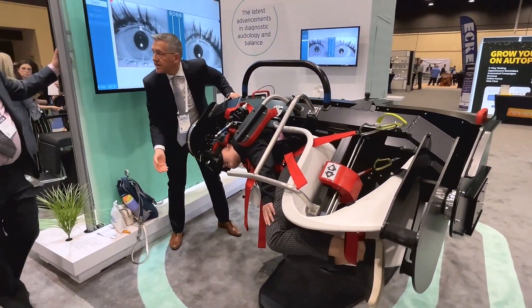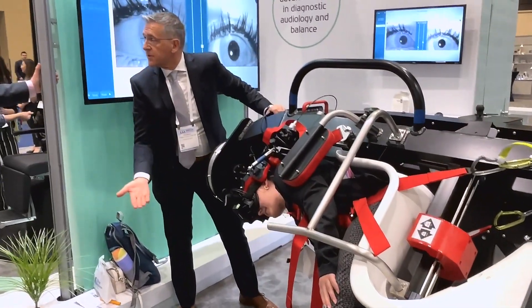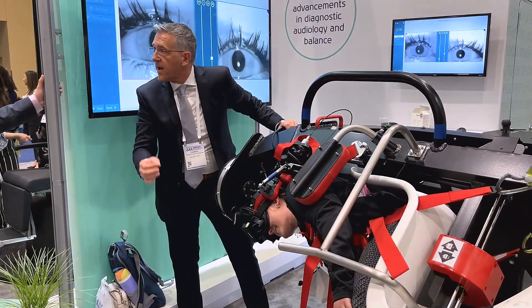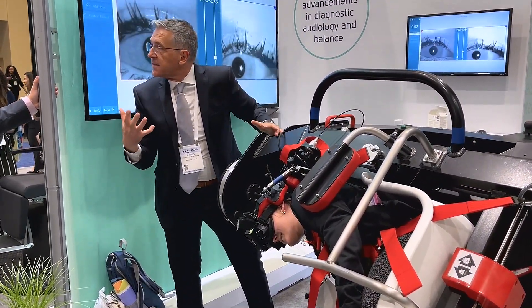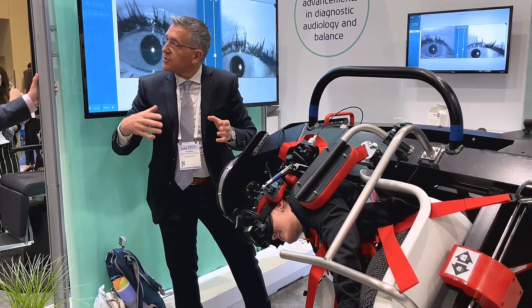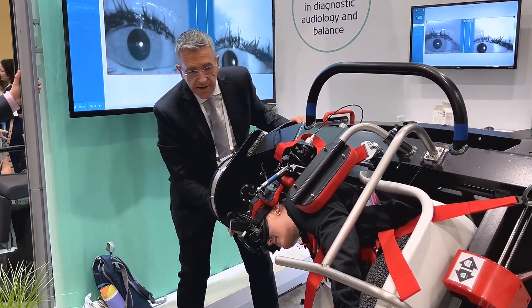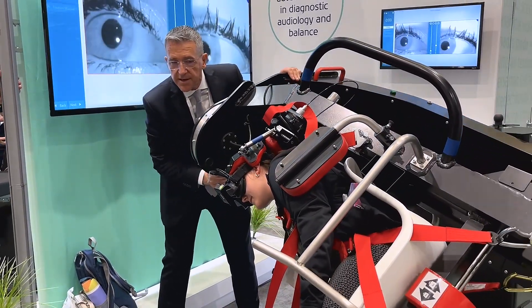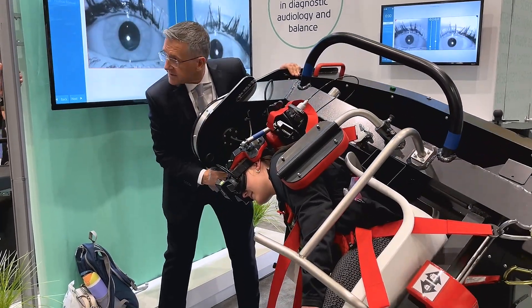Then we'll make a barbecue — a dynamic barbecue — with impacts to transmit kinetic energy to help the particles progress into the canal. So we'll make, like that, some impacts.